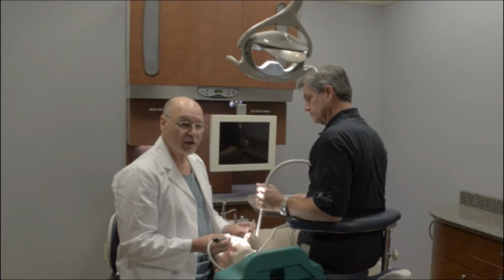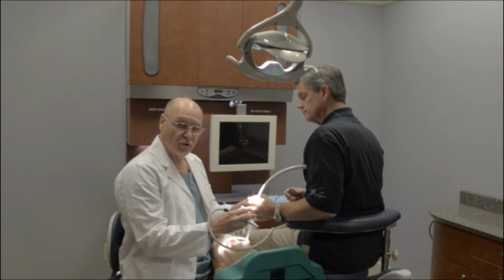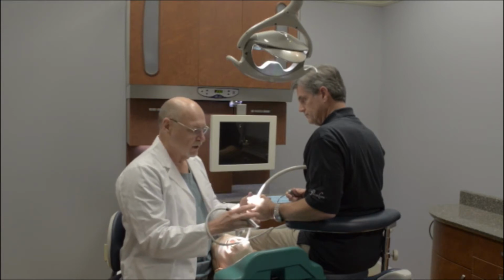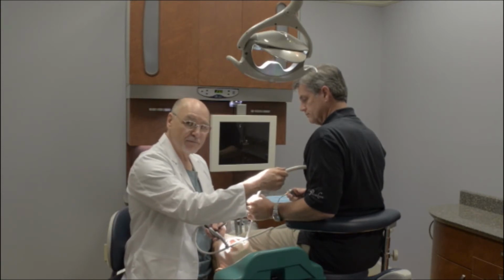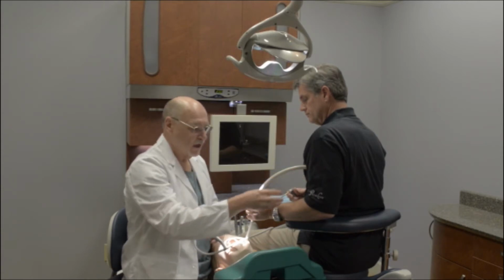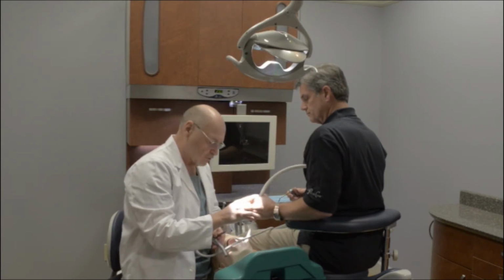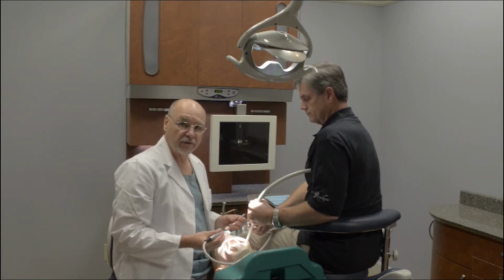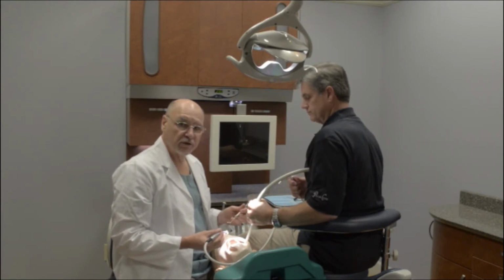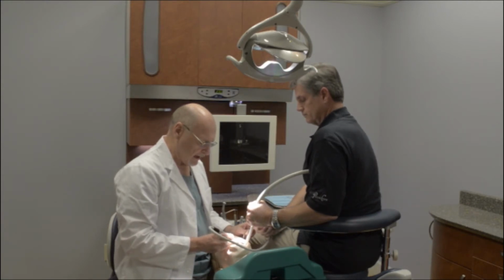Now the assistant's going to be bringing up the high-speed suction, placing the high-speed suction in their left hand using a dagger grip as opposed to a pen grasp so that they don't fatigue small muscle. Also, you'll notice that the assistant has placed the high-speed suction underneath the left arm to take all the drag off of the wrist. Now they're going to be using deltoid muscle here to actually retract the cheek, really enhancing the endurance of the assistant, and bringing up the three-way syringe for clearing the mirror. So we would begin the procedure and cutting the prep using the handpiece as well as the three-way syringe.